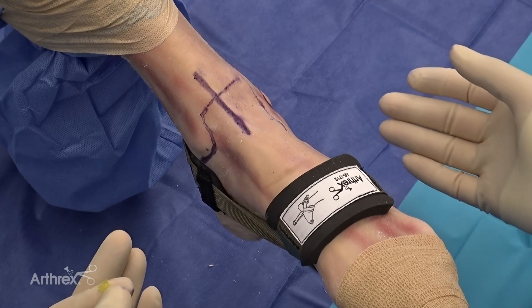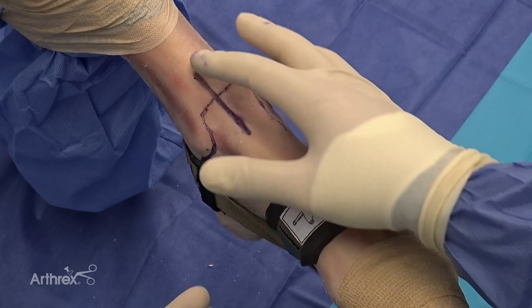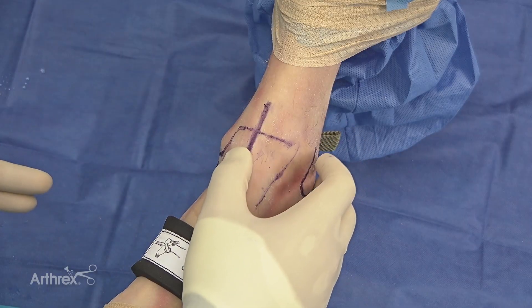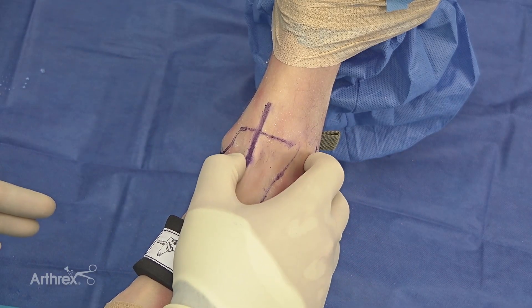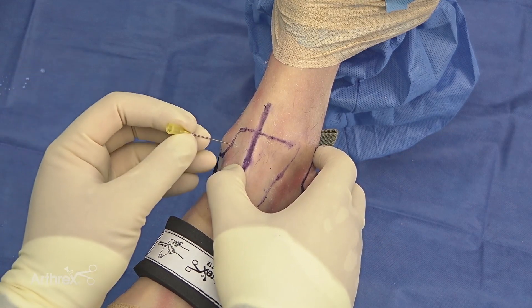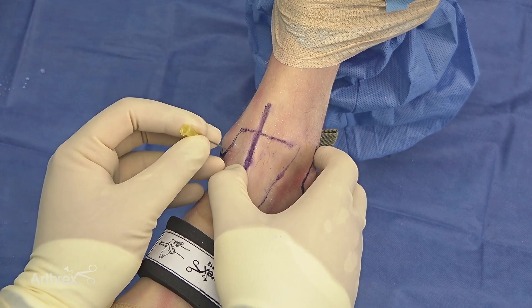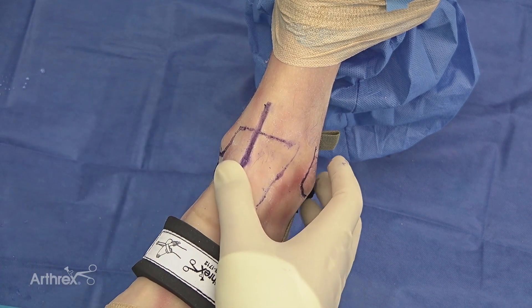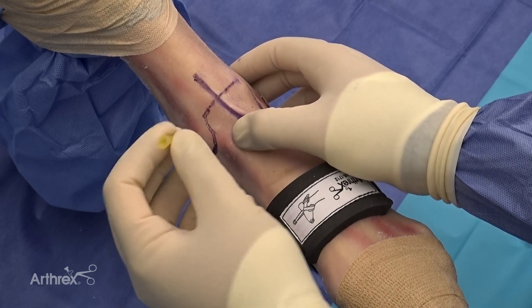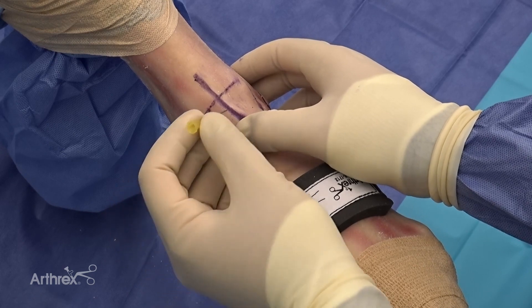As we begin our ankle arthroscopy, we'll start by palpating the tibialis anterior. We can feel it as it's in a little bit of tension right along the anterior medial portion of the ankle. I'll initially begin my arthroscopy by palpating the joint with a 22 gauge needle along the medial border of the tibialis anterior, using my thumb to sweep the tibialis anterior out of the way as I begin palpating at the joint, initially beginning at the distal tip of the malleolus.